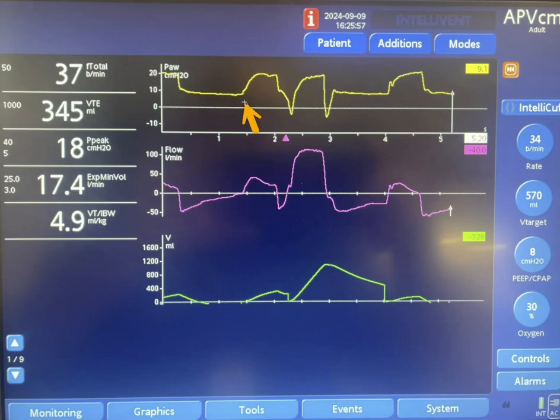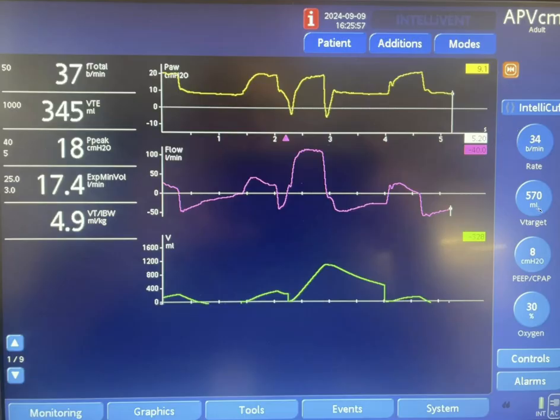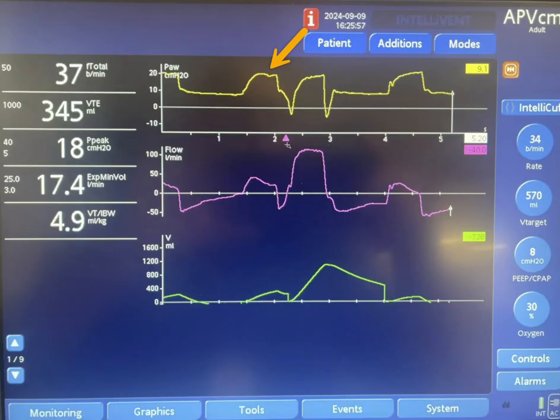The next breath looks like it is time-triggered — there is no negative deflection here. The pressure goes up again to a value that should have been higher than the previous one, because the volume was not delivered as targeted. It should have been increased by around two to three centimeters of water each breath. This breath is actually delivered by the machine with a decelerating flow waveform, and again notice that the volume did not reach 570 — it is around 400 here.